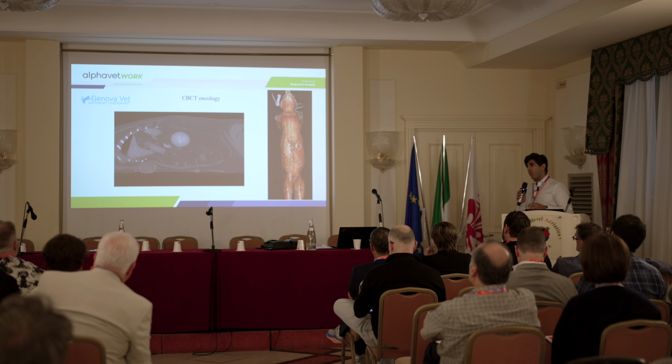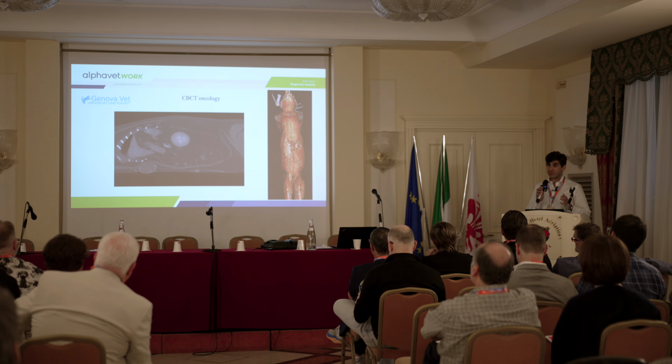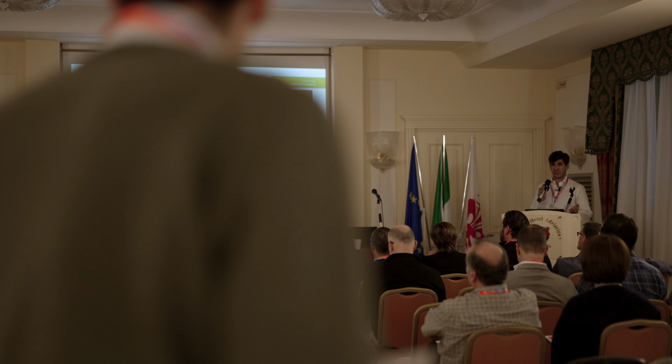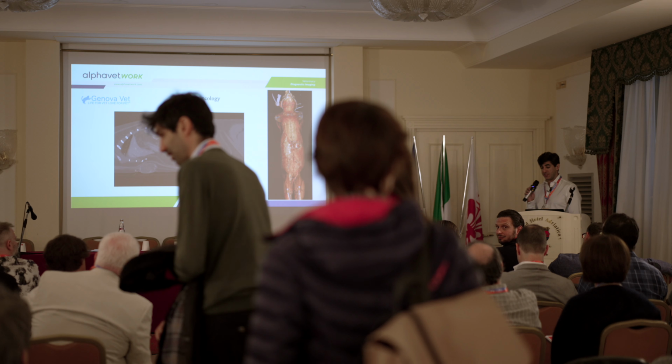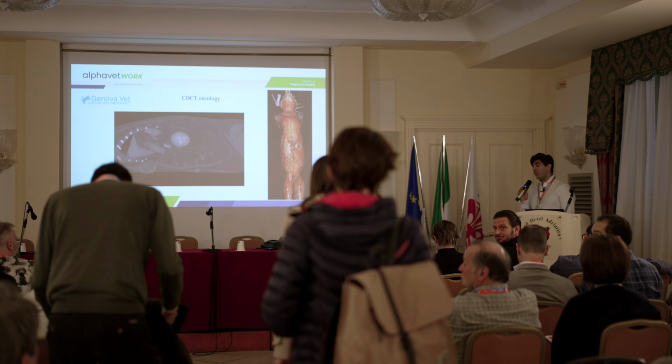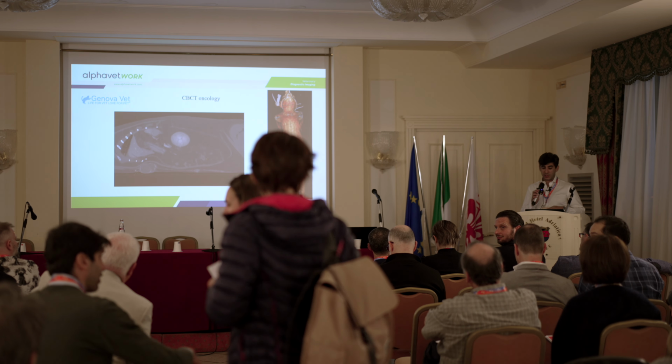But where I'm focused, as you see in the literature, was only on teeth. What we care about now, mostly, is orthopedics, a lot of cases with the CBCT, but it's easy to understand that the carpus and tarsi are very well presented with a CBCT rather than with a CT.